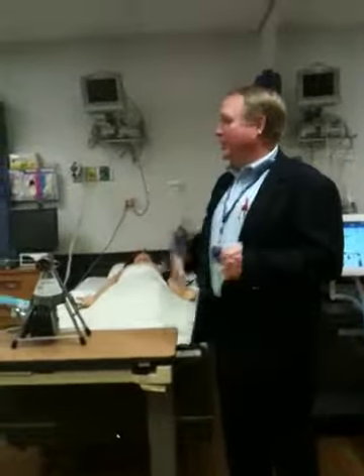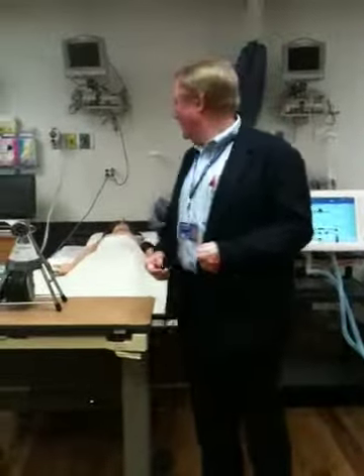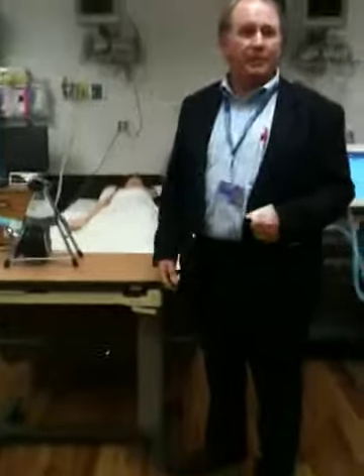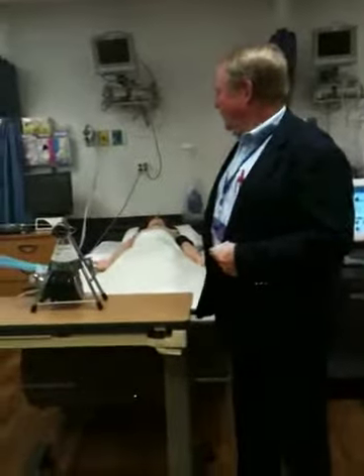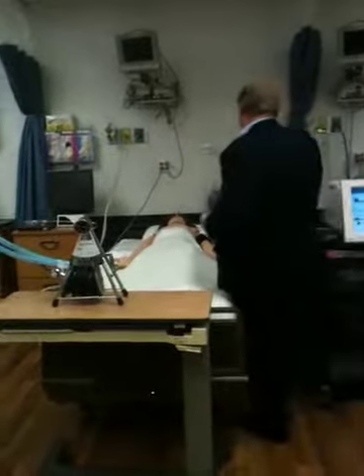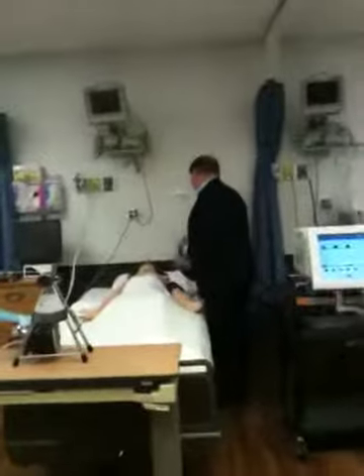Here you're going to be doing your patient assessments. You're going to be taking pulse oximetry. What is that hanging out of her mouth? These are ET tubes. They intubated them earlier today. And then we can hook them up to the ventilators too. These are small ones. They're going to put 7.0s and 7.5s. These are 7.5s.